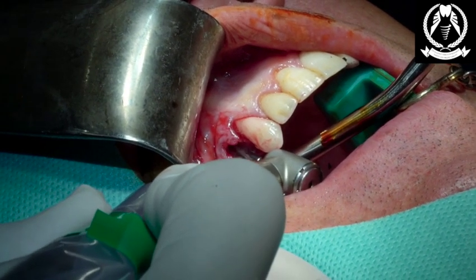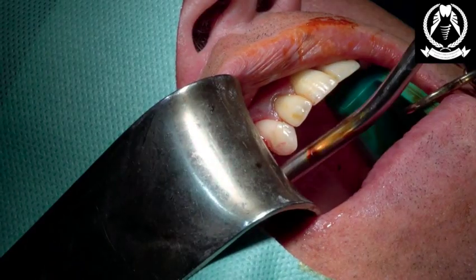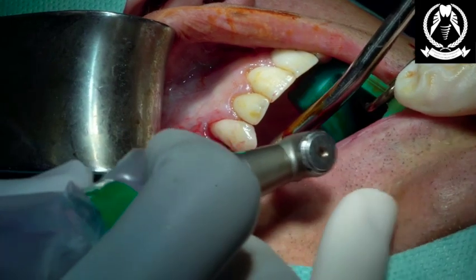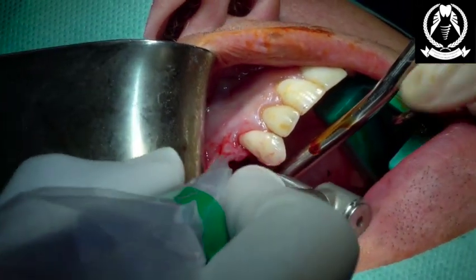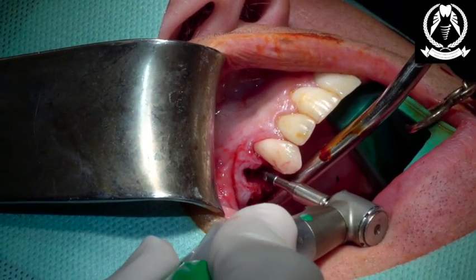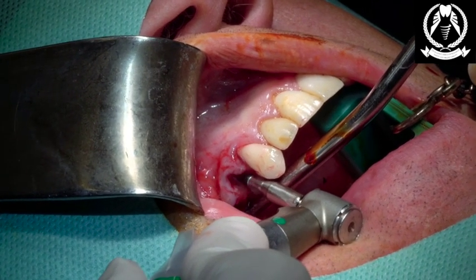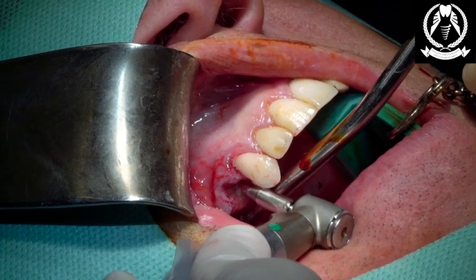Alan, how you doing? Good man. Okay, we use something called a drill extender just to extend the drilling surface, to get a little bit more leeway, a bit of sinkage. We're going to look in there. A little bit wider, Alan. Cheers, buddy. Just going a little bit distal from that root. A bit distal, and I'm going to feel that sink it down to where we need it. Open, Alan. Thank you.